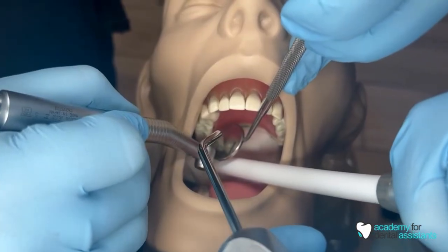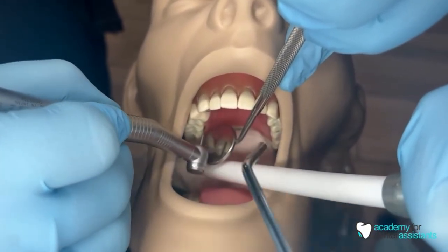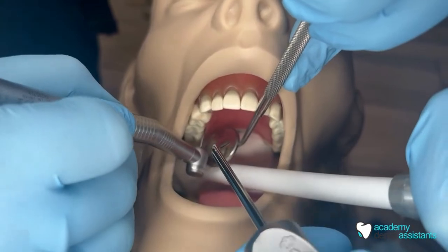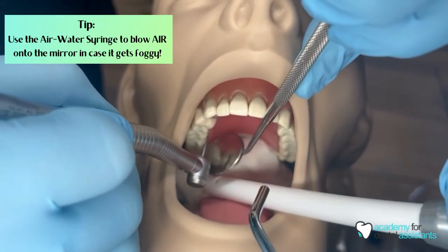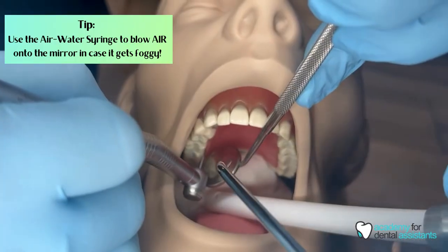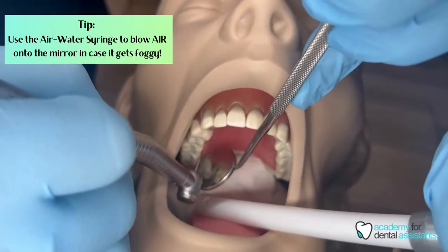Now we're going to be working on the lingual side of number three. The doctor is going to have their mirror on that side and we have the air-water syringe here. We want to make sure that we blow air onto the mirror in case the mirror gets foggy, so the doctor can see exactly what they're working on. We have the HVE right underneath the mirror in case we need to suction up any extra debris.